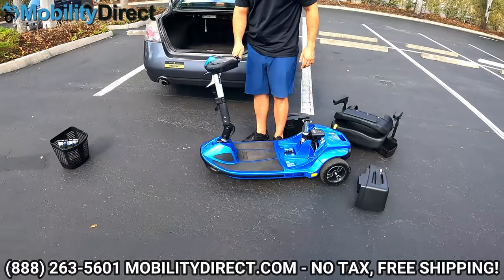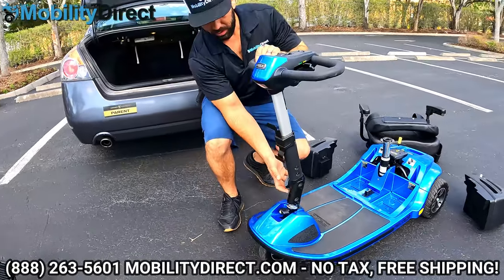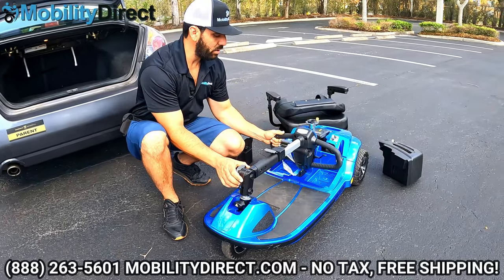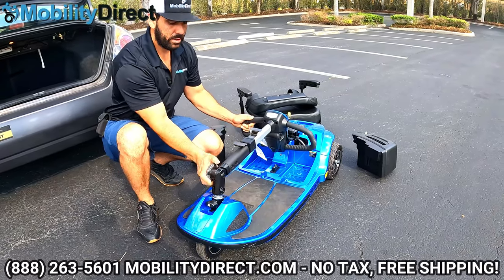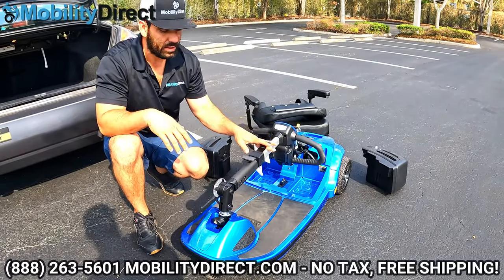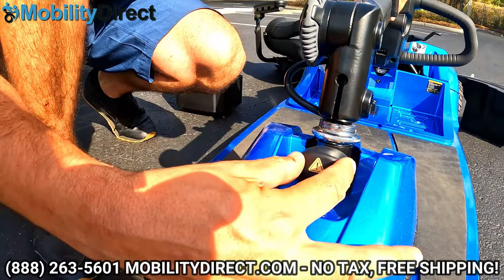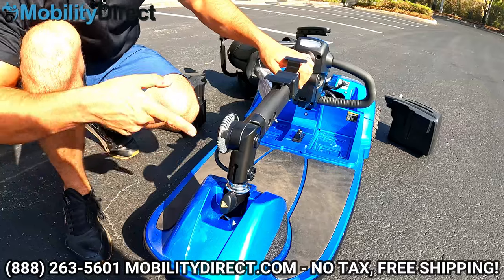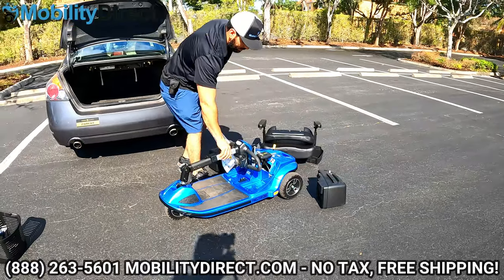Next, lock the steering assembly so the steering wheel doesn't swing around. First, loosen the tilting adjustment knob, bring the tiller to about a 90-degree angle with the steering column, then lock it in. Use the spring-loaded knob to lock your steering wheel — this prevents it from swinging in the trunk and scratching the other pieces. Remember to unlock it when you put the scooter back together.